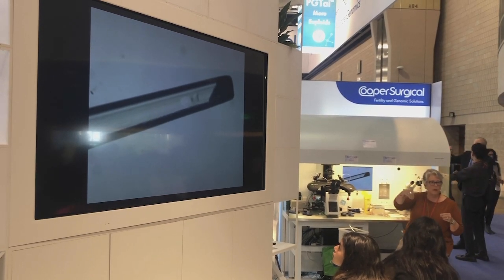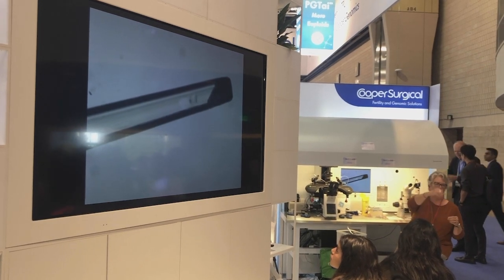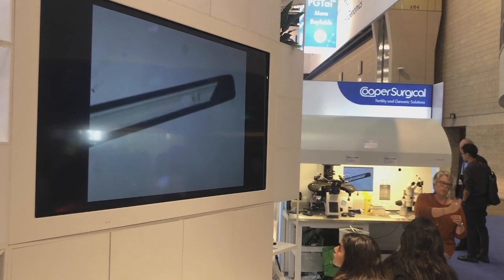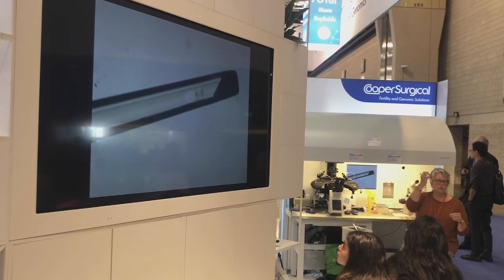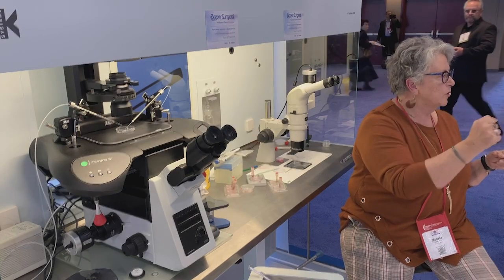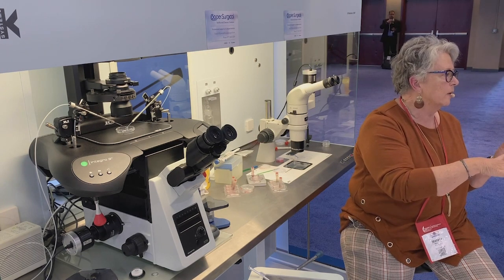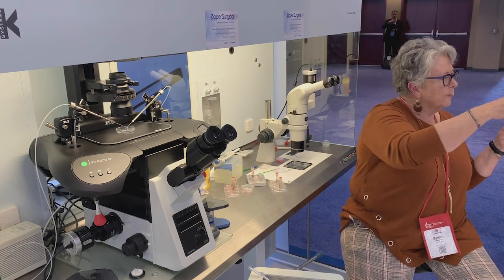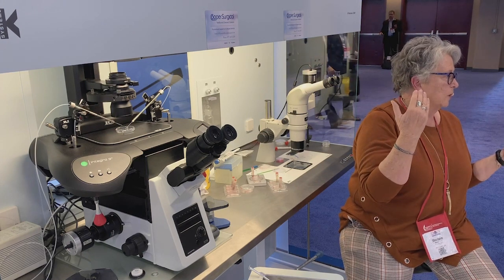But if it hadn't come out immediately, I would have touched it again, and touched it again, just sort of working my way up the tip away from the black end. And capillary action is going to pop it right out of there. So you don't have to expel. You don't have to do much to it at all. It's just going to pretty much come out on its own. And then if you're just tapping your way up the device, you don't have to really go in and pull up solution off of that.